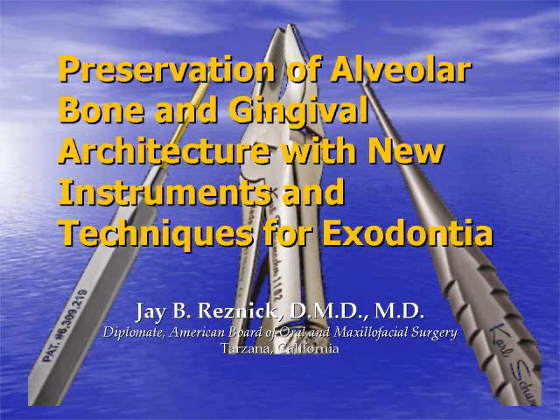In this video, we're going to learn how some new extraction instruments designed by Karl Schumacher Instruments allow for the atraumatic extraction of teeth with the preservation of alveolar bone and gingival architecture.